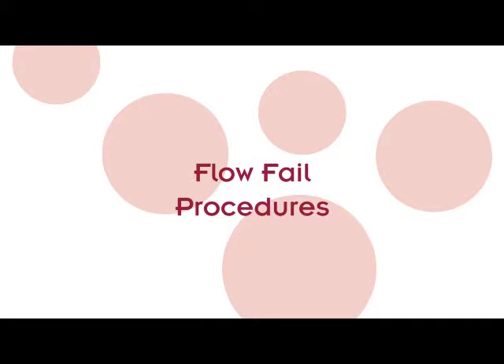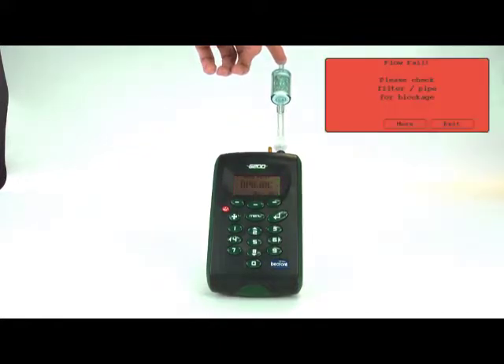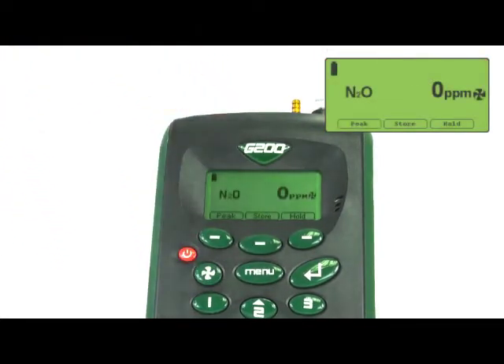Flow fail. Should the flow fail screen appear, as reconstructed here, you can press the fan button twice to quickly return to the monitoring screen. If the problem persists, please refer to the manual included for a detailed solution guide.